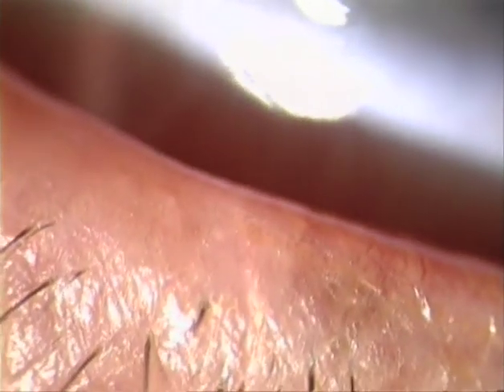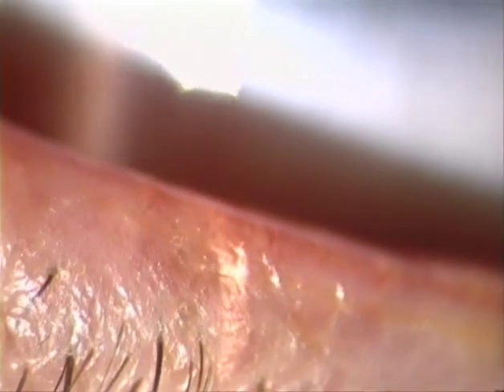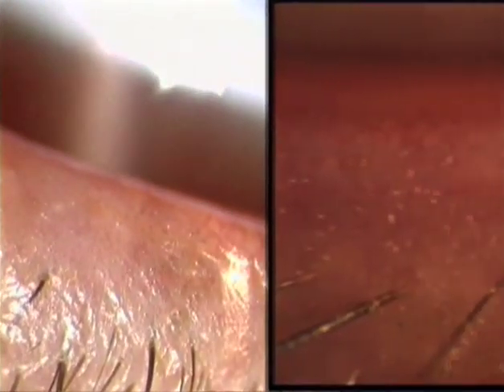There are no orifices of tarsal glands, and what we see at the lid margin is debris of keratinized epithelium. Compare this with a normal lid margin.